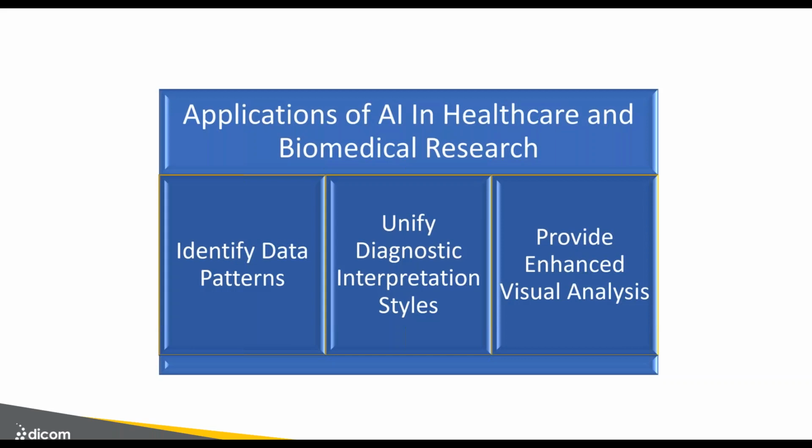Obviously, they're really practical. Additionally, there are algorithms we see that combine multiple diagnostic interpretation styles. So we all know, for example, if you have two radiologists who are reading the exact same study, they might produce very different diagnostic reports, but both are valid. Each might contain beneficial nuances. And we'll see something interesting related to that a little bit later in our discussion from that CMIMI conference that we attended recently.